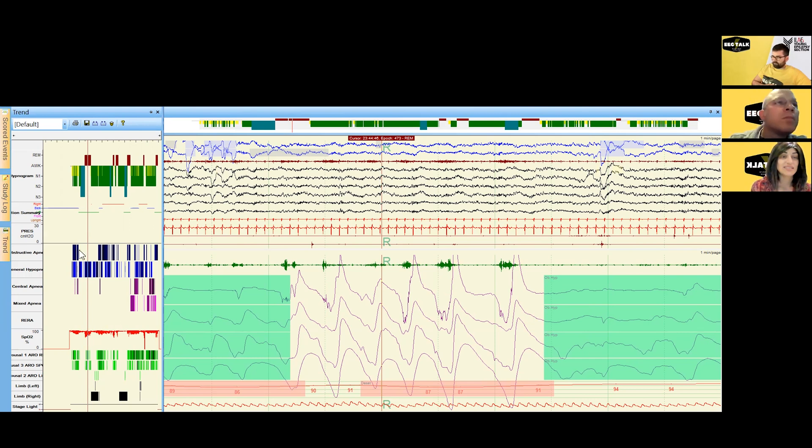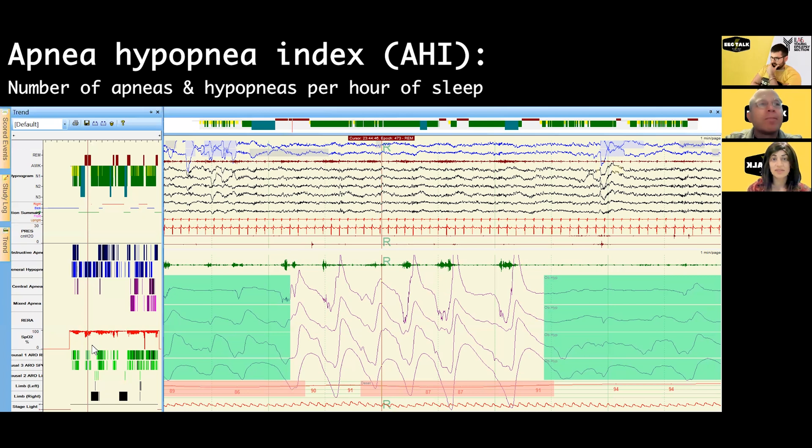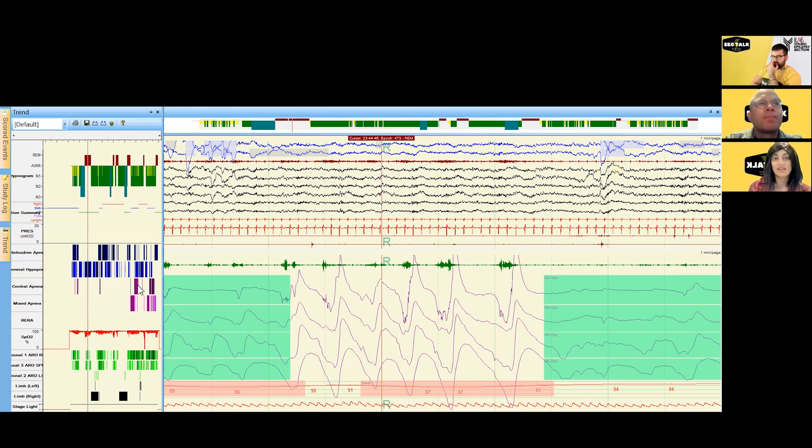Right now we're in an epoch of stage REM sleep and you can see pretty profound hypoxemia occurring in stage REM. The apnea-hypopnea index — the AHI — is the number of apneas and hypopneas per hour of sleep. Once all events are scored, we generate a report that calculates how many of each event per hour of sleep, and that becomes the index.